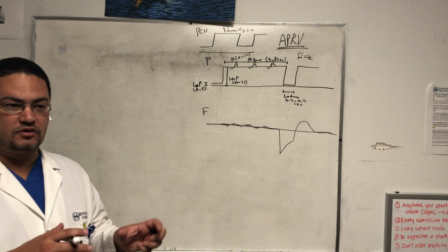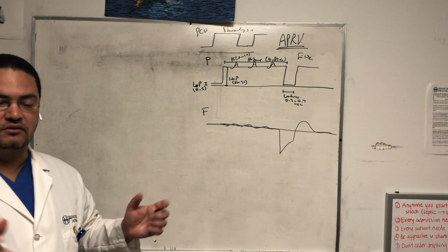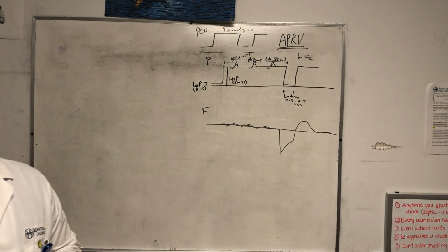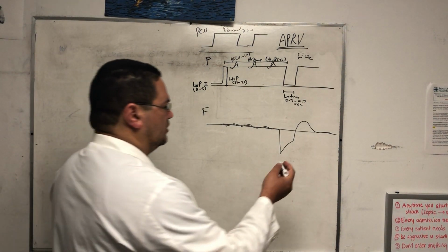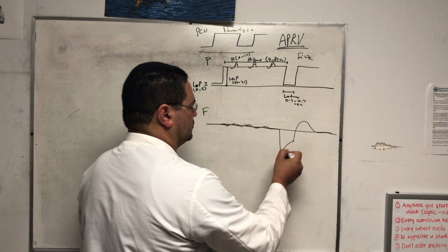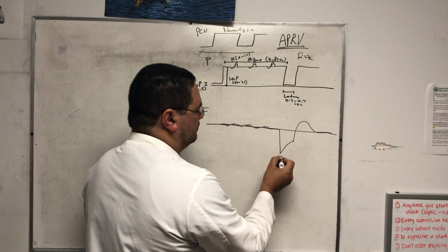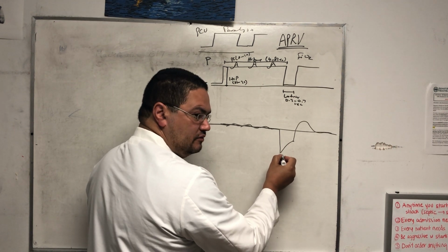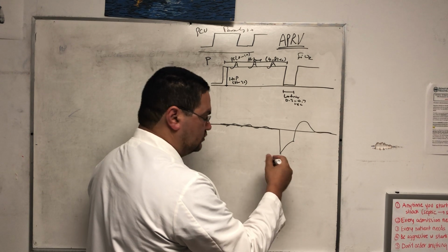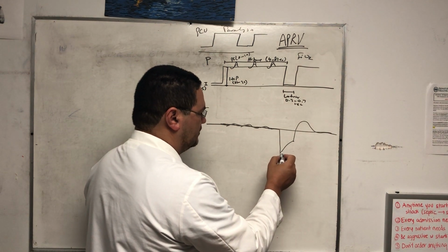But you have to regulate it, because if you don't regulate it and let it be, it might actually pop the patient's lung or cause severe reduction in the venous return. So how do they regulate it? They measure a ratio. We measure the ratio every 2 hours. We put the cursor on this curve here at the lowest part of the curve. You gotta do this every time we have a patient with true, classic APRV.